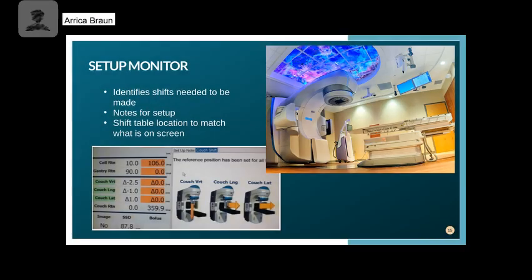As I mentioned, we do have what's called a setup monitor. That's typically hanging from the ceiling. We have a couple monitors here. Whenever we bring up the patient, it's going to be very specific to their information. That's why it's really important that you have the correct patient pulled up. Because if you go in the room and you still have your previous patient pulled up, the information is going to be wrong and you're going to set them up wrong.